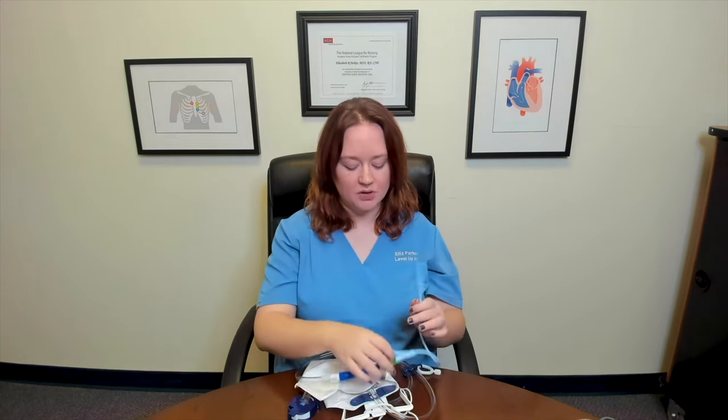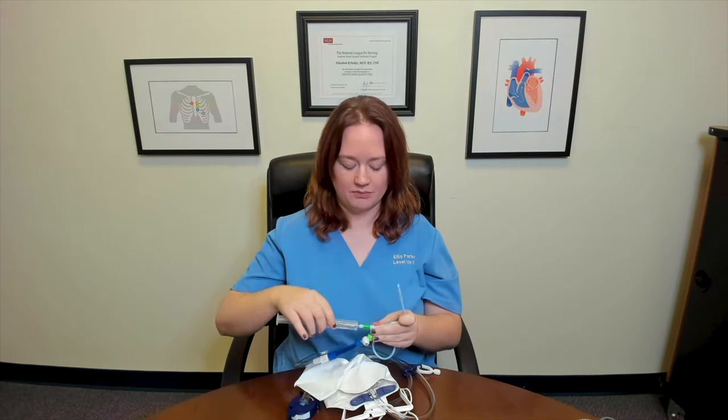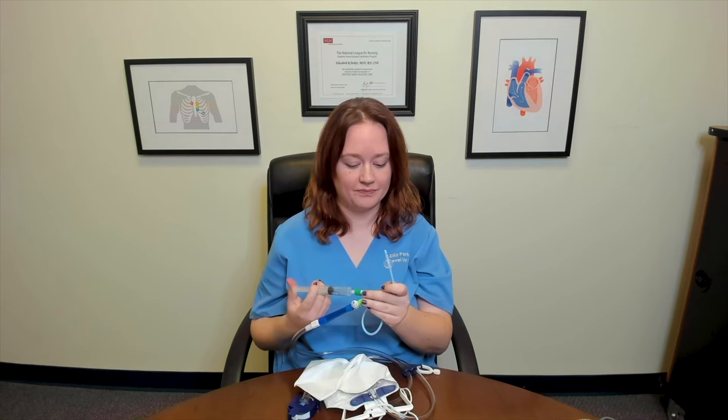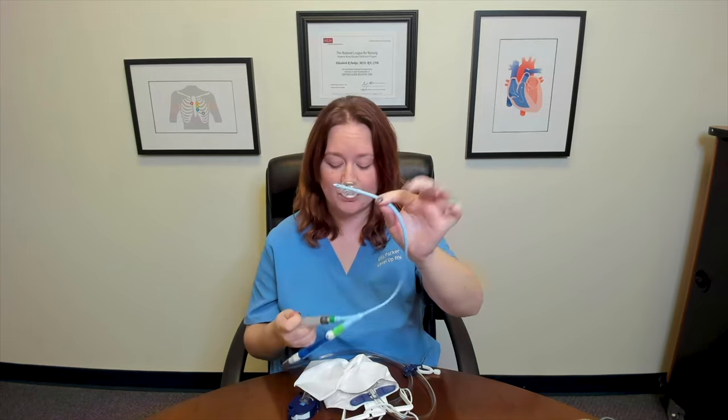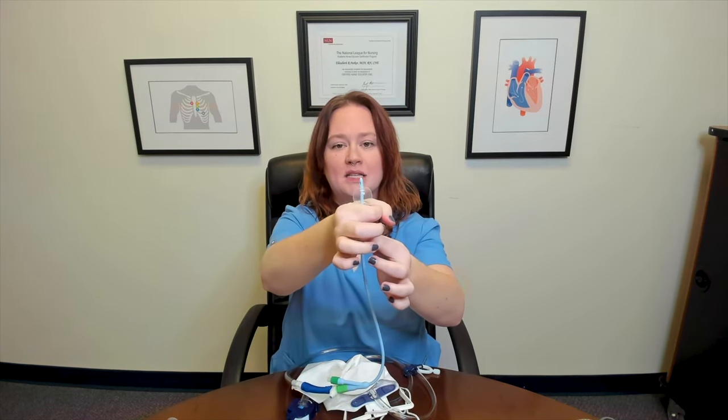I wanted to take this opportunity to demonstrate a couple of things about catheters that you may not get to see before you go into practice. The first thing I want to show you is the balloon — you know now that I'll attach my balloon syringe and inflate the balloon after it's already been inserted. This is what that looks like — it's pretty big. I just really wanted to give you a visual representation of what's inside your patient. This is why we tell you to gently tug on the balloon, because it's sitting at that opening into the urethra and we want it to settle so urine doesn't leak around it. This is also why it's really important to make sure that the tubing is secure to your patient's leg so that this doesn't accidentally get pulled through their urethra intact — you can imagine that would cause extensive damage.